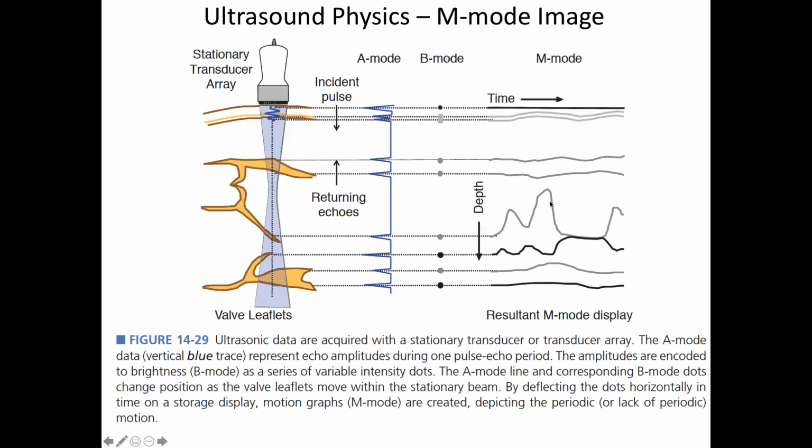And in this mode, this is called M mode. It's just B mode versus time. So we just make B mode images, they're 1D pictures, and you just watch them over time. And then you can answer really cool questions like, what is the fastest velocity this valve leaflet achieves, right?